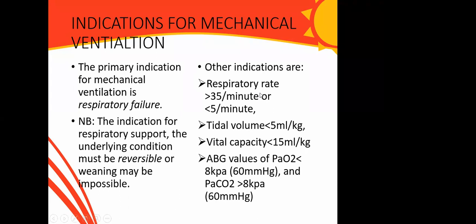We have other objective indications for mechanical ventilation: respiratory rate less than 5 cycles per minute or greater than 35 cycles per minute, a tidal volume of less than 5 ml per kg, vital capacity less than 15 ml per kg.